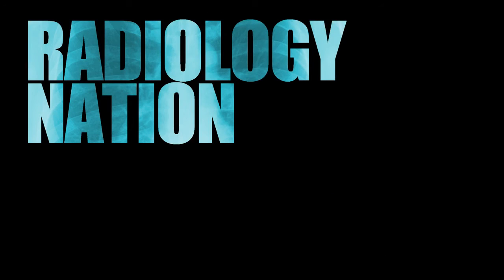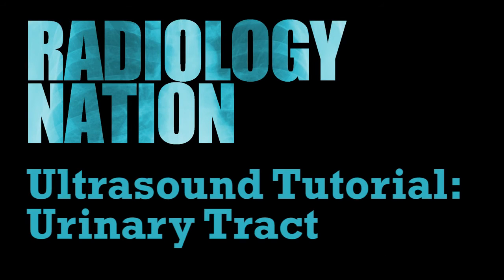Throughout this video, we have demonstrated the technique for ultrasound assessment of the urinary tract, highlighting the relevant anatomy and pathology along the way. This should provide the basis for you to practice and perfect your own method.